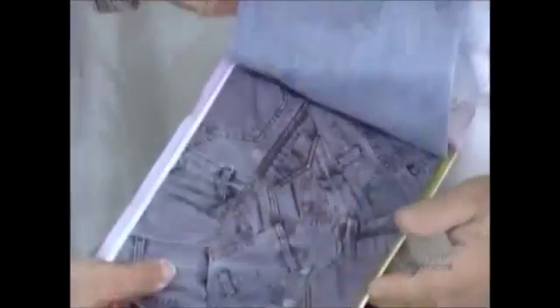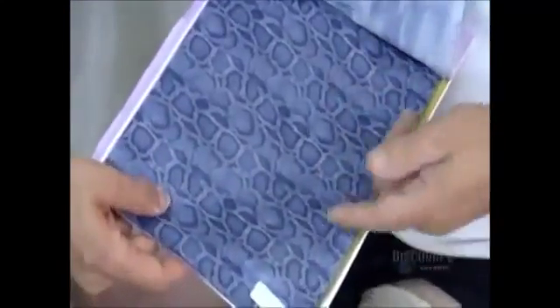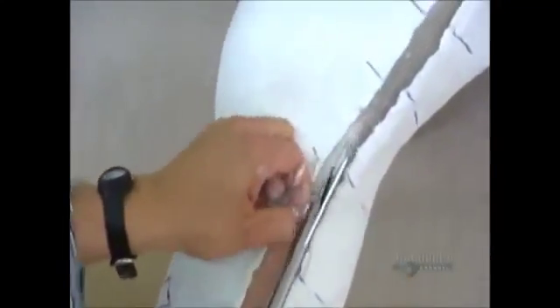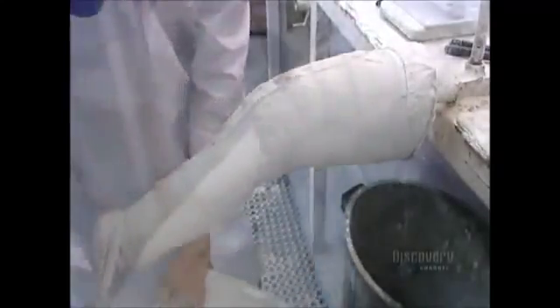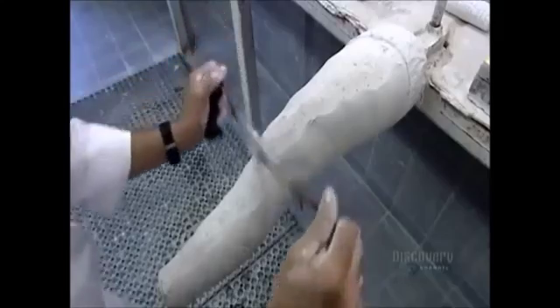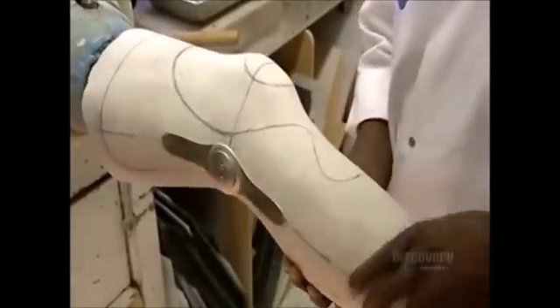While waiting for the fast-set plaster to harden, the patient chooses a decorative pattern for the outside of the brace. The hardened cast serves as a mold. Technicians pour in plaster, let it harden, then remove the cast. After smoothing the surface, they draw technical markings, then install the lightweight aluminum joints that'll enable the orthosis to bend.